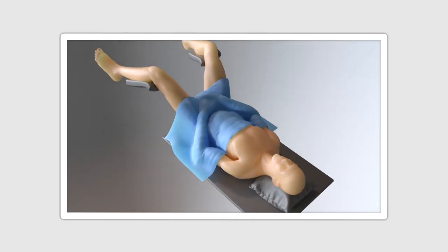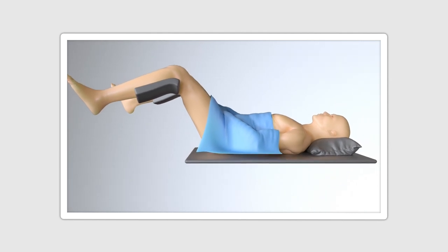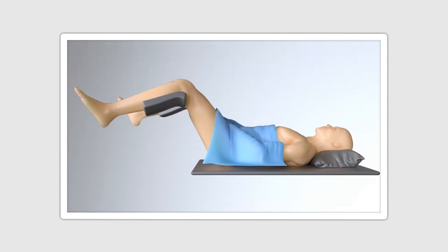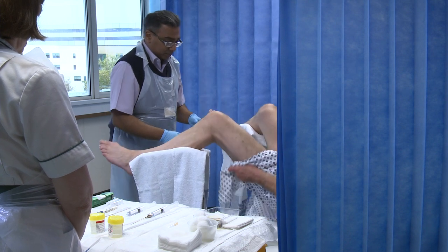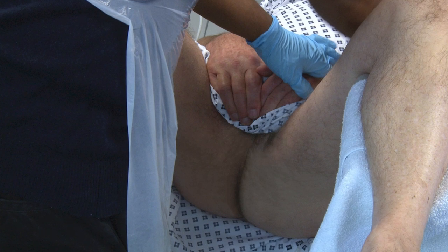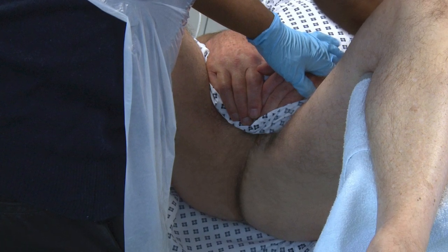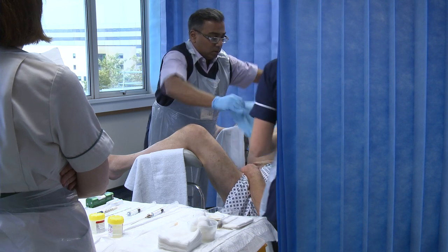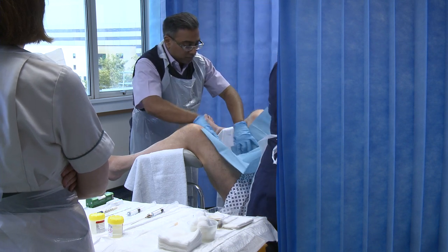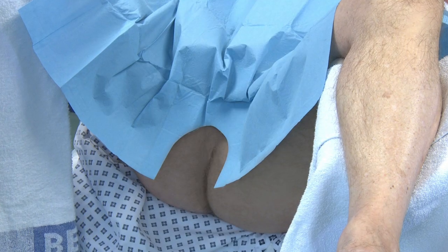For the procedure, a reclining bed with removable lower section is required, with stirrups for the patient's legs. The position is standard lithotomy with no extension required. Patients are asked to hold the external genitalia up onto the abdomen with a slight degree of tension, and a sterile drape is placed over the lower abdomen and, if necessary, separate drapes over the thighs. The perineal area is thus exposed, ready for the procedure.